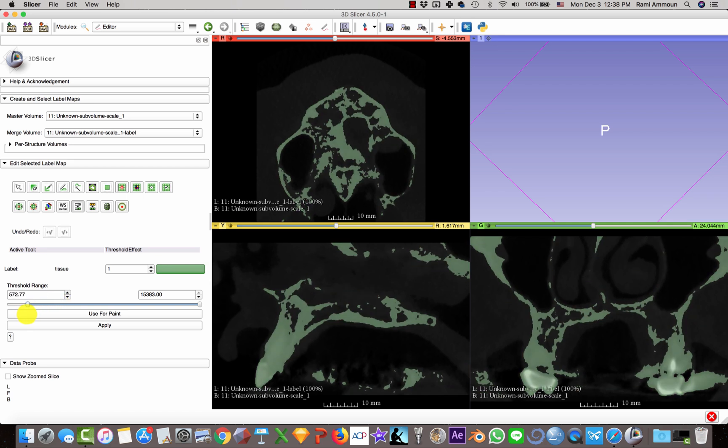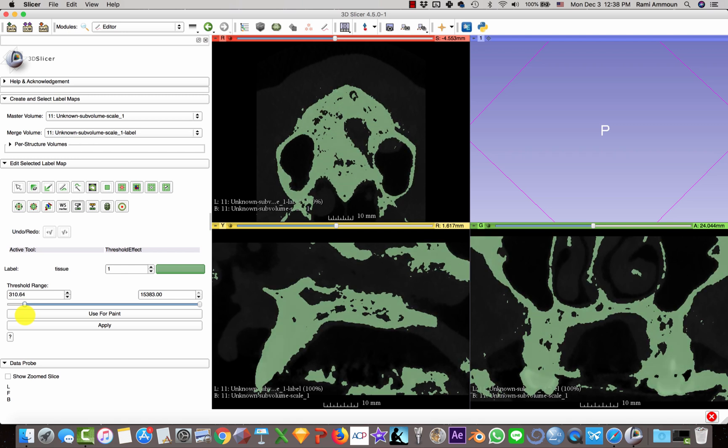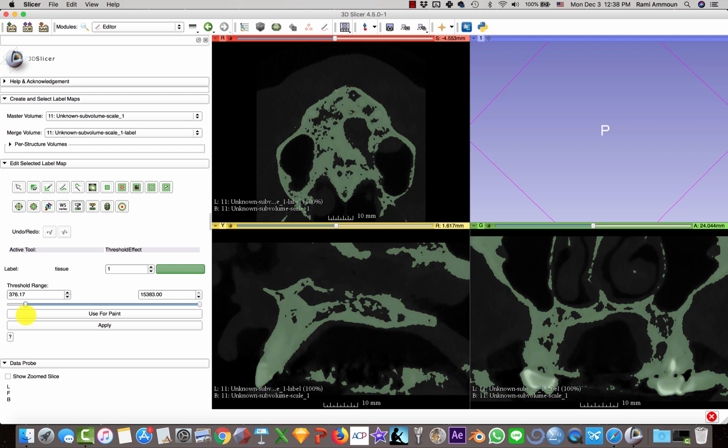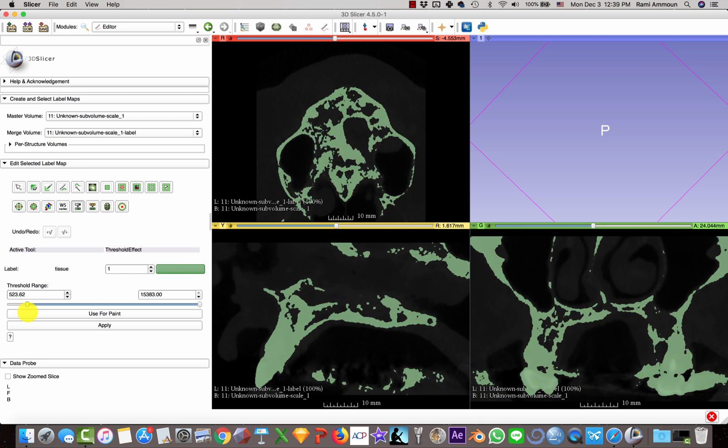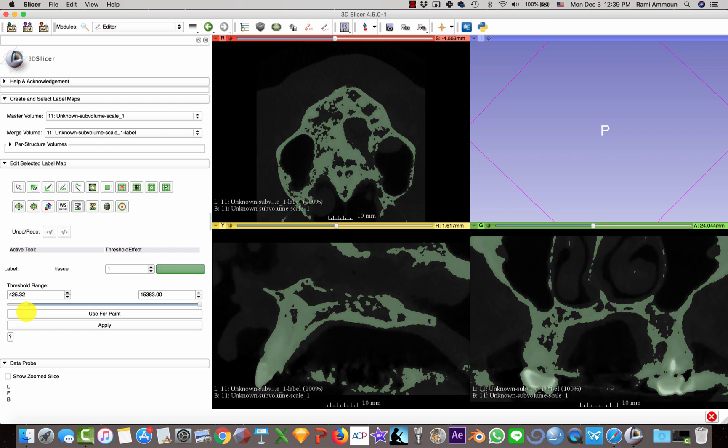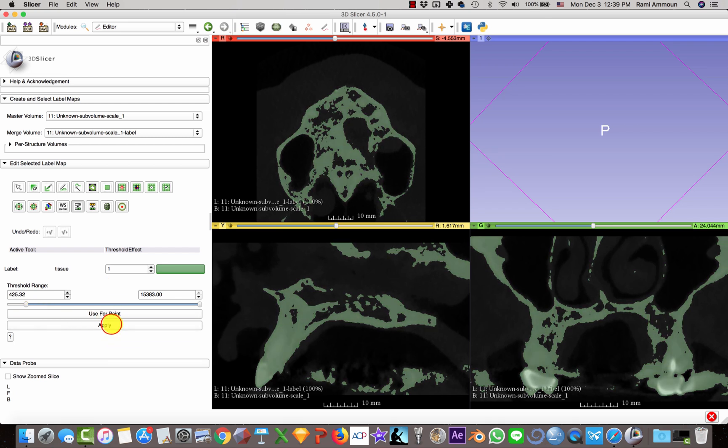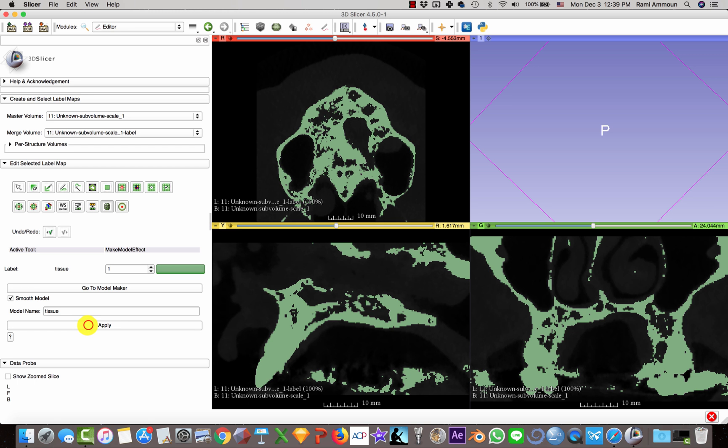I'm going to play with the threshold until I feel that this is the bone that I need. It's basically trial and error. Then click Apply, and then here you click on Make Model, click Apply.